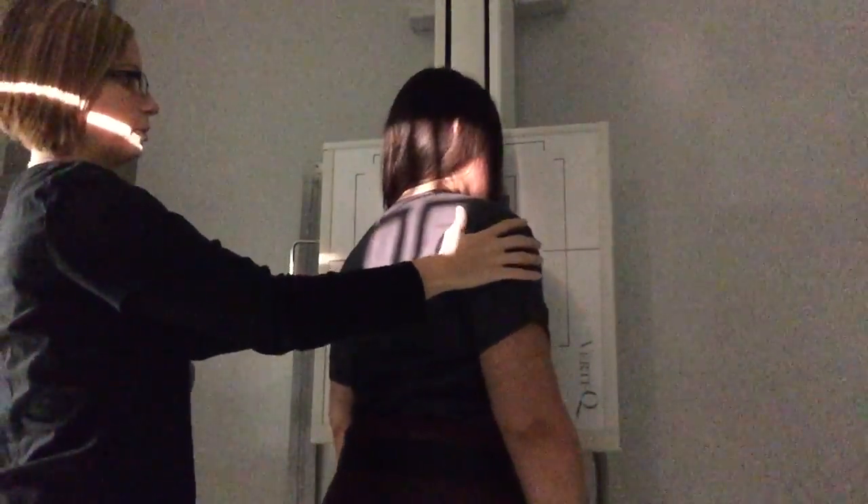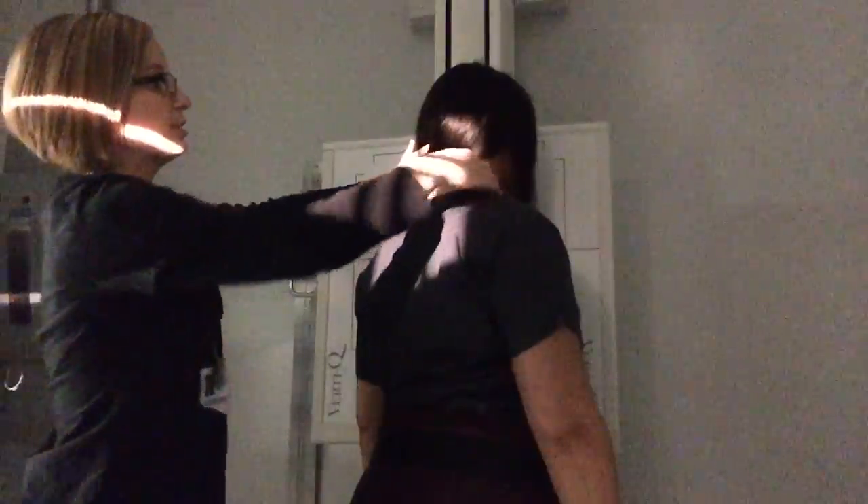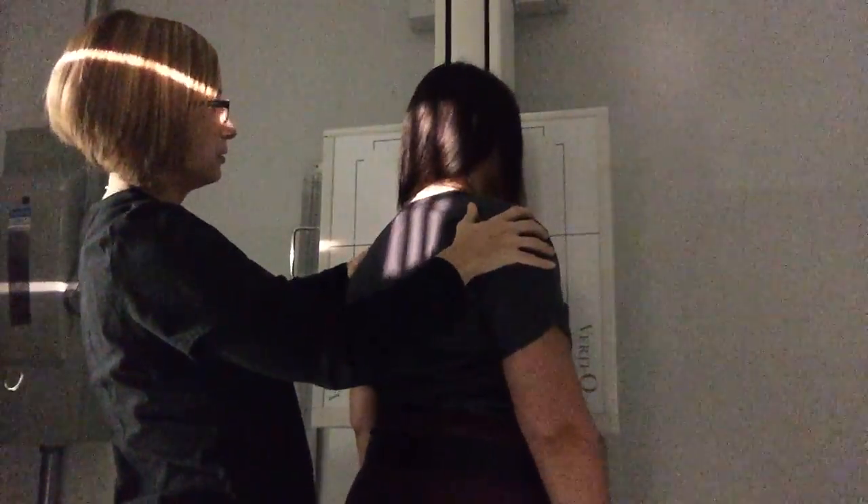Turn the patient at a 45 degree angle and have her step forward just a little bit. Center still at the Adam's apple — you can take your finger and follow it all the way around. It's also going to be right about C4 if you need to use that instead. Collimate in and make sure the patient lifts their chin up and pushes it out just a little bit.